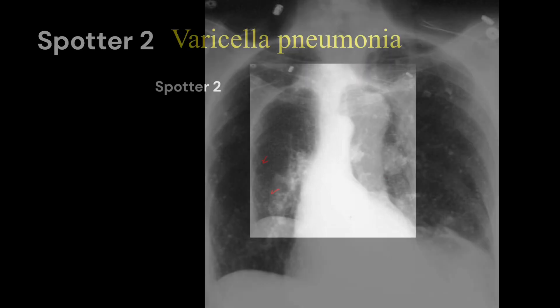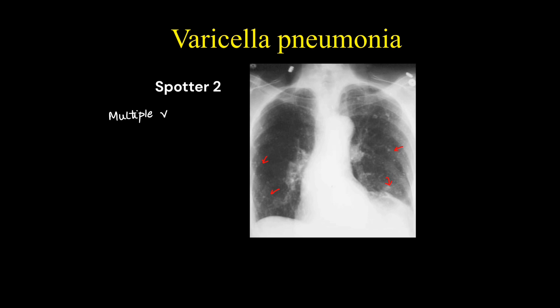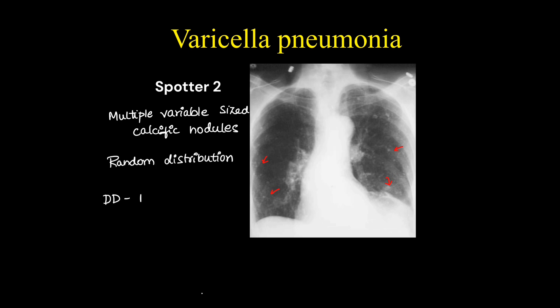In this case, we can see multiple variable-sized calcified nodules in random distribution. This was a case of varicella pneumonia, which is also one of the differential diagnoses for miliary nodules. The other differentials for these cases are the ones that present as miliary nodules.